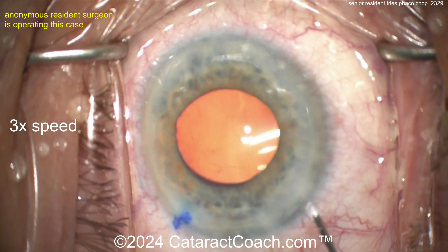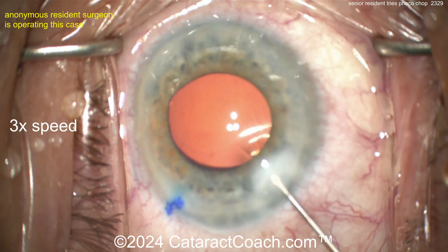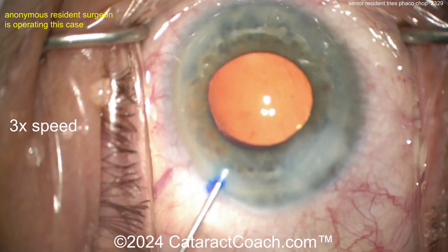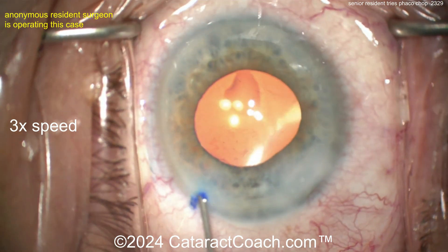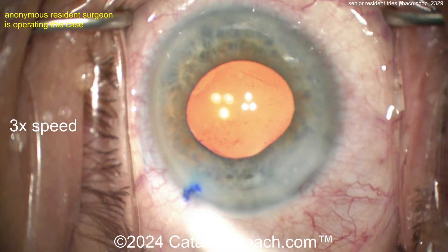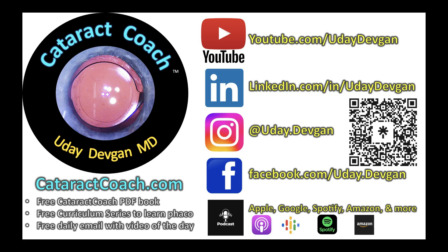What a lucky patient — going from that opaque cataract to this beautiful result. Hydration of the incisions is good. Easy, easy — don't overdo it. Make sure the lens is in the bag, it looks great — call it a day. I am so proud of you, young Jedi, whoever you are. Keep up the good work. Remember — CataractCoach.com, free PDF book for residents, anyone learning cataract surgery, just go check it out.